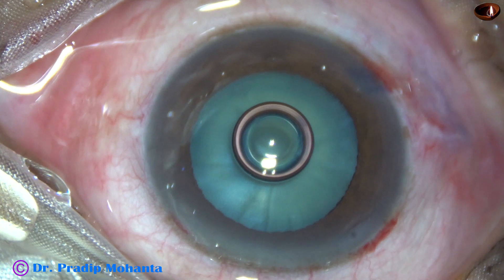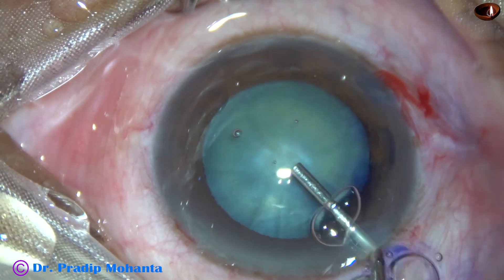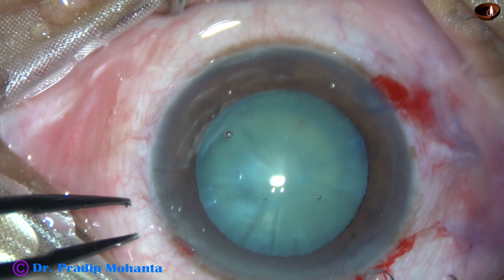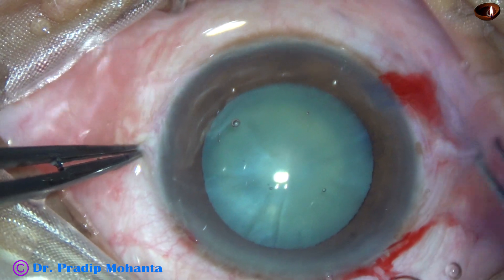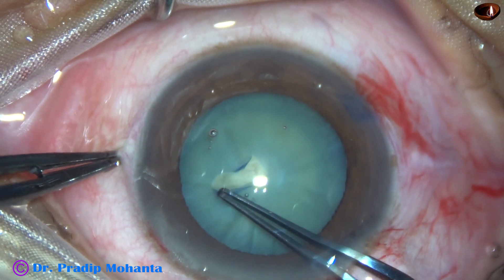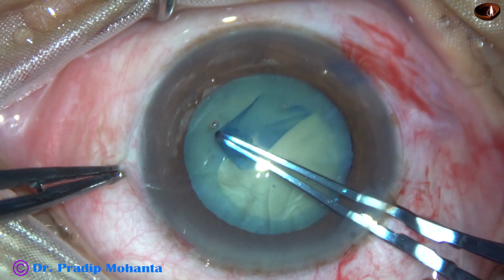The dye has been washed out. Now 2% hydroxypropylmethylcellulose is injected to fill out the anterior chamber, and now is the time to do capsulorhexis. Tear off the capsule, hold a tag, go anticlockwise.